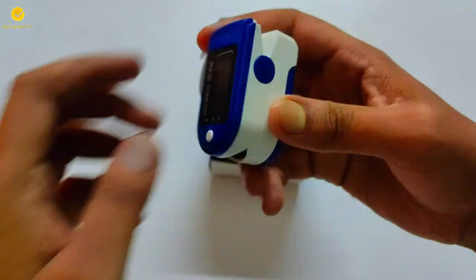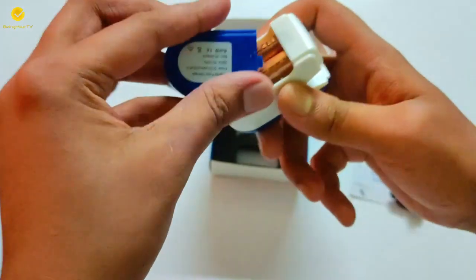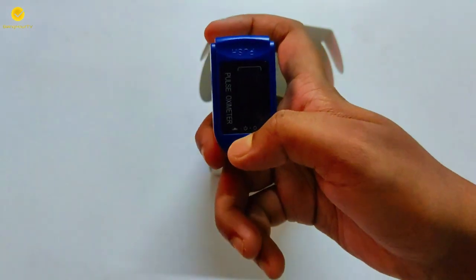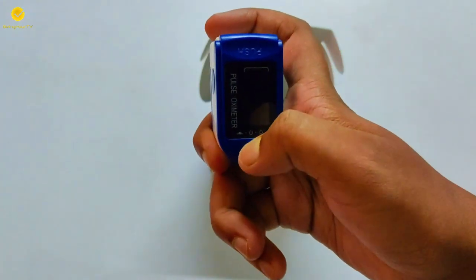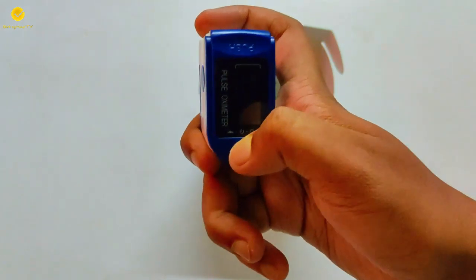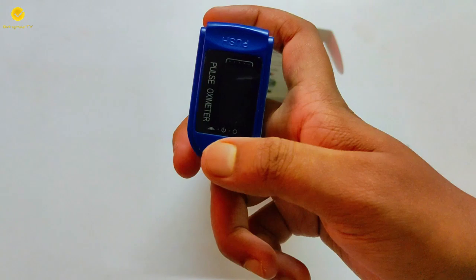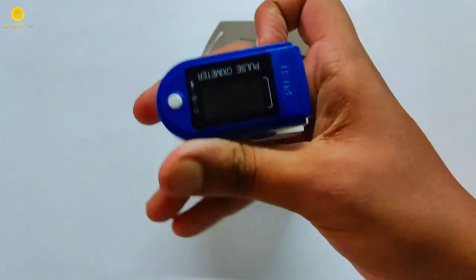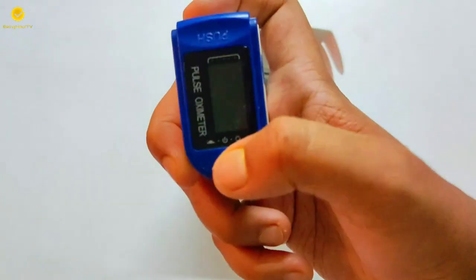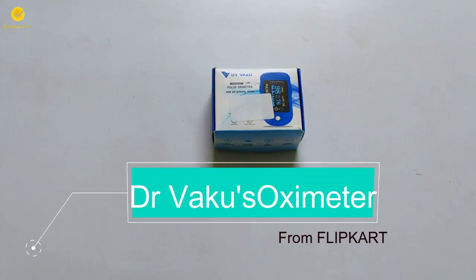It took around 10 days to get delivered, and today I finally received the product. I was very happy — I could now ensure my oxygen level is fine. But when I unboxed it and tried to turn it on, the product was dead. I thought maybe I was doing something wrong, went through the user manual, looked for any other button, but I was wrong — the product was actually dead.